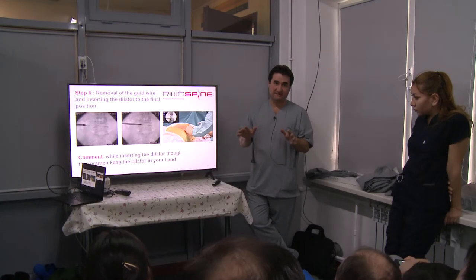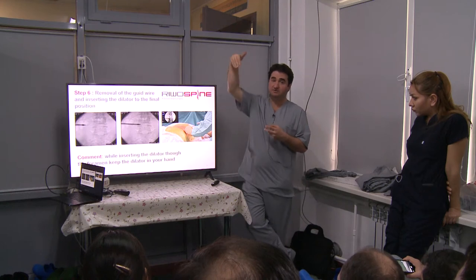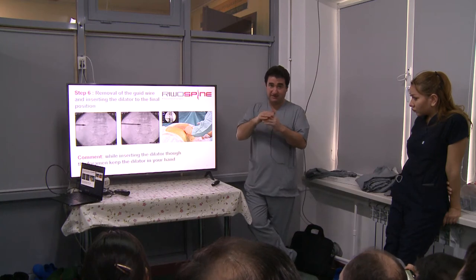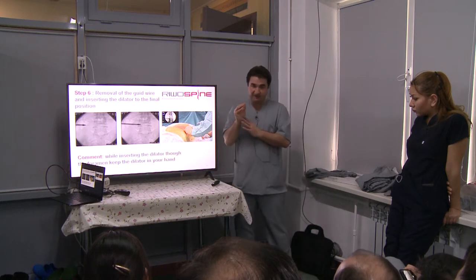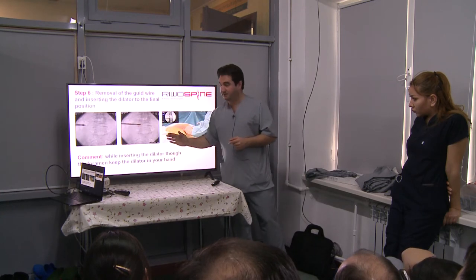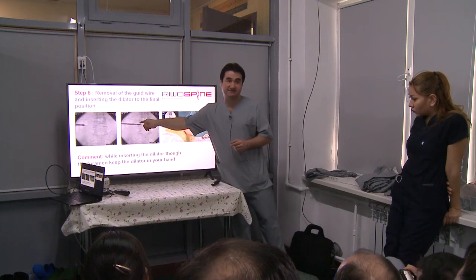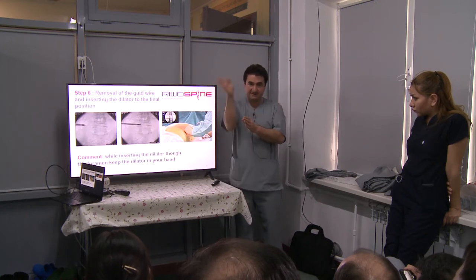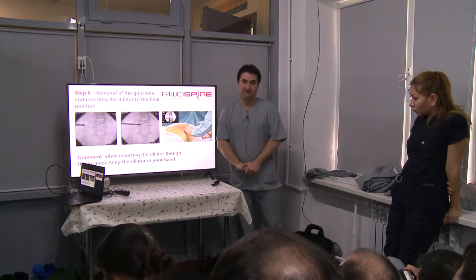If there is something inside the spinal canal, like herniation, and if you don't want to do it interlaminar, you want to do it transforaminal, then first you have to resect to get more space in the foramen, and then you have to go. Otherwise, the hypertrophic facet or the narrow foramen, while you are inserting your dilator, will push your dilator to the cranial side. Yeah? And then you will squeeze the exiting nerve root in this situation. To prevent this, we stay outside and resect the facet joint and get access to the spinal canal. But usually we don't do it.